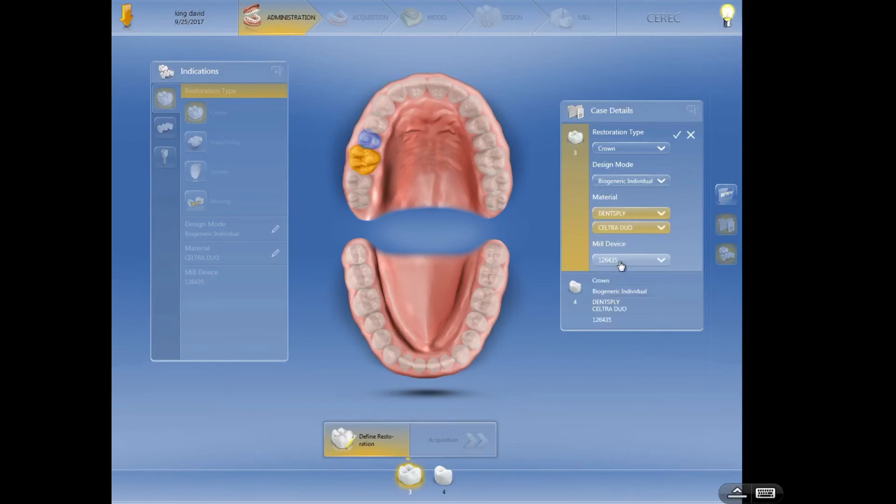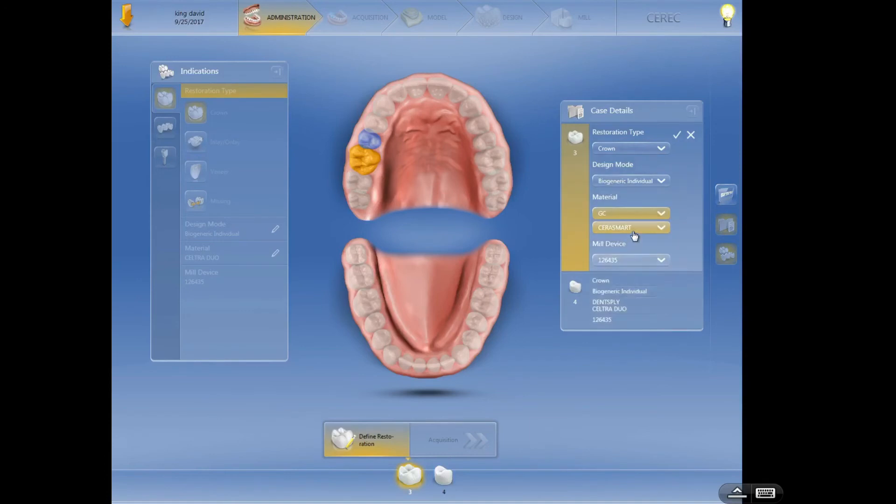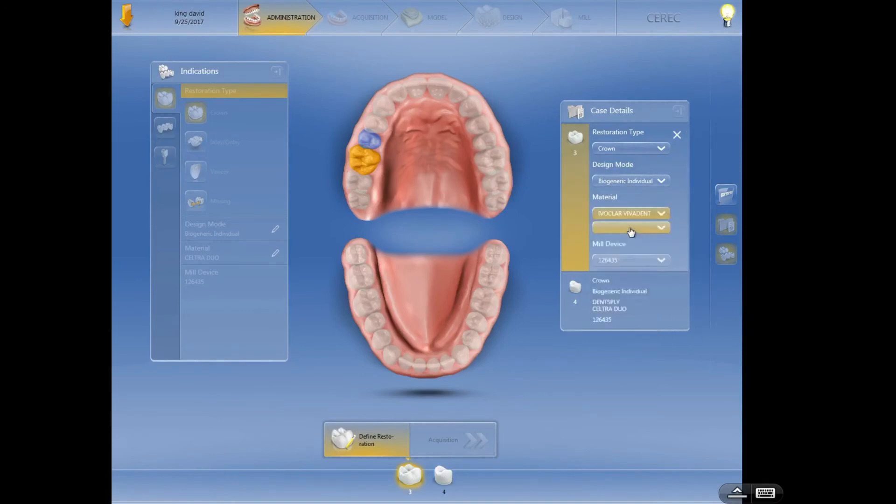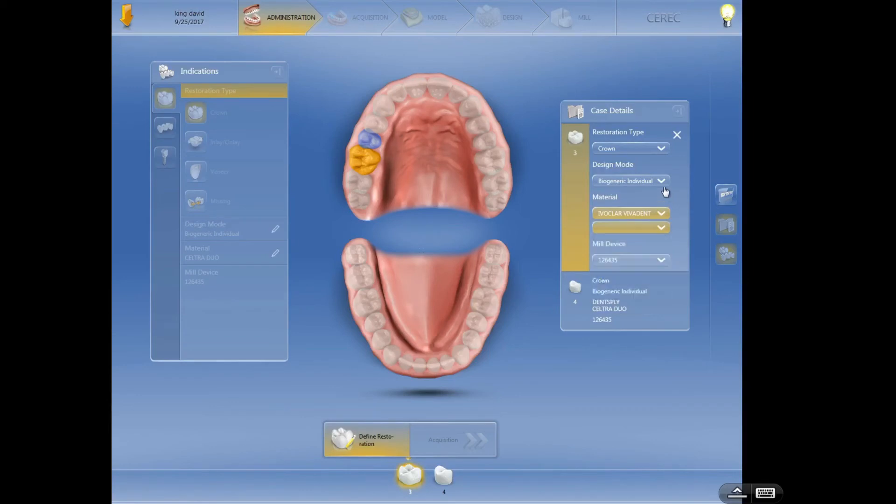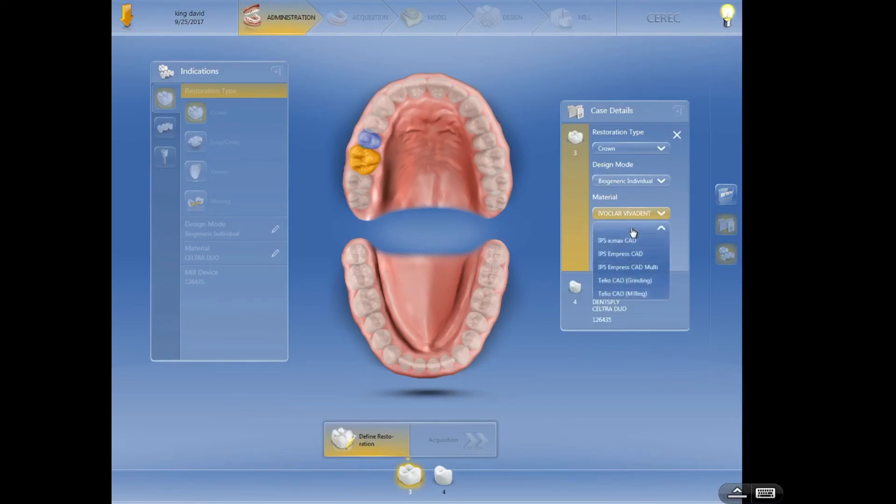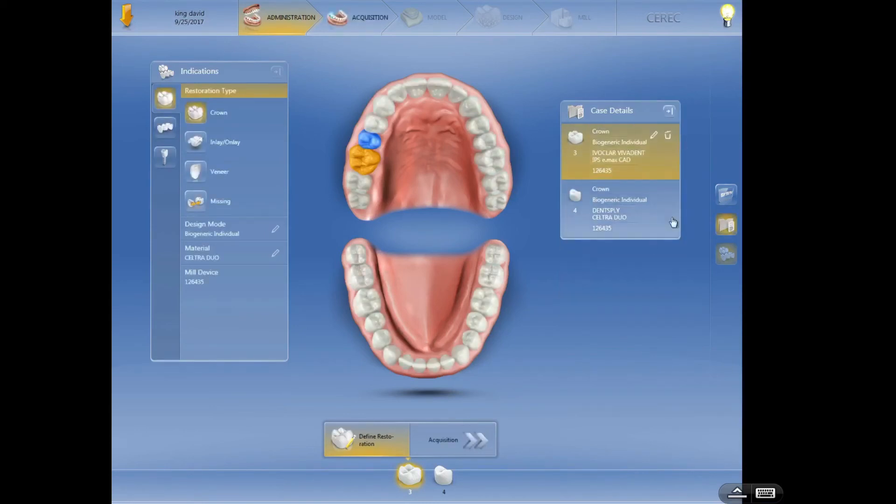Let's see, I want to get to Celtra Duo, that's a Dentsply product. Celtra Duo automatically populates there, there's no other option there. Or if I wanted to go to GC CEREC smart, there it automatically populates. Or Ivoclar Empress CAD or Empress multi, whatever you want to do there. A bunch of choices here. So once you're done editing that, hit apply and then you get back to this screen right here where we can move forward if you want to.